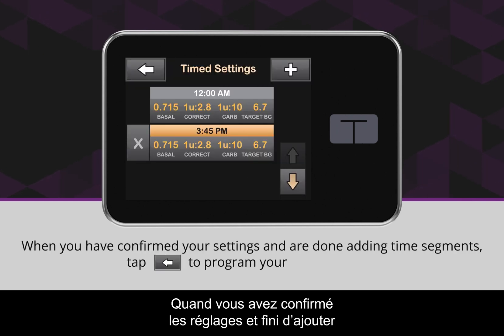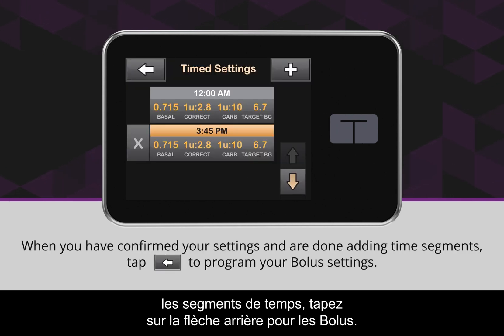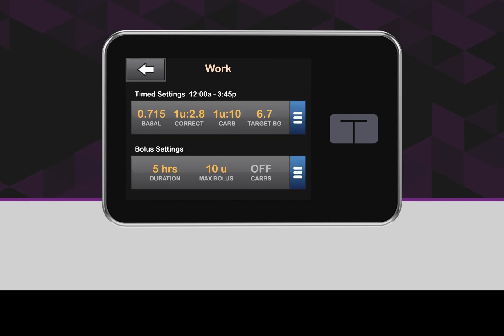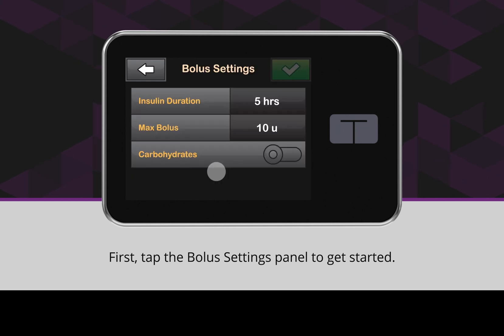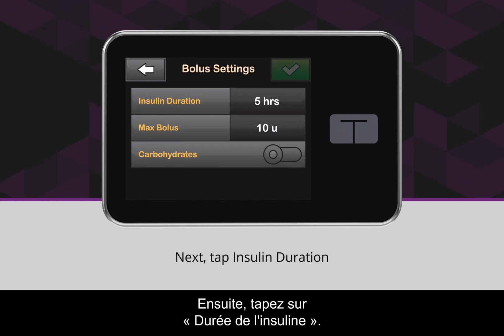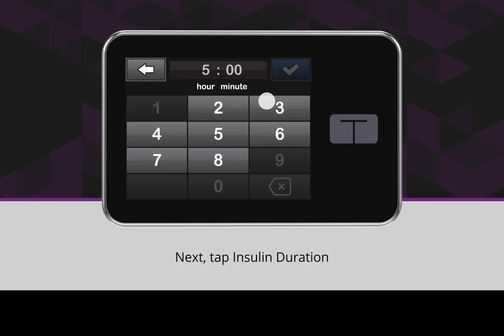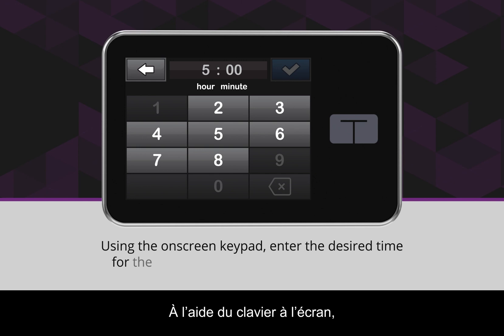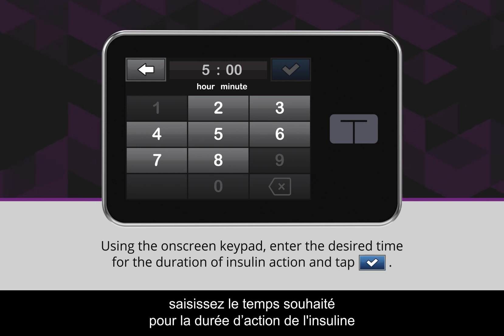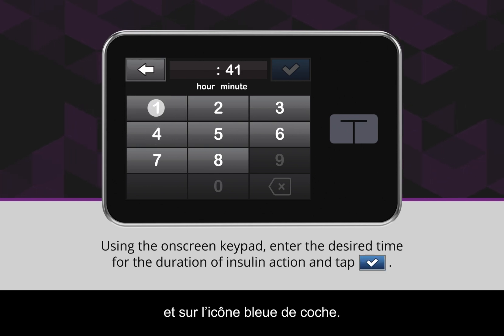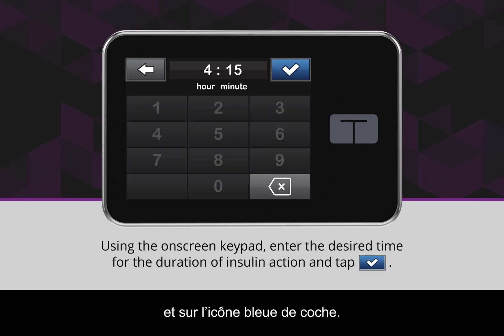When you have confirmed your settings and are done adding time segments, tap the back arrow icon to program your bolus settings. First, tap the Bolus Settings panel to get started. Next, tap Insulin Duration. Using the on-screen keypad, enter the desired time for the duration of insulin action and tap the blue checkmark icon.